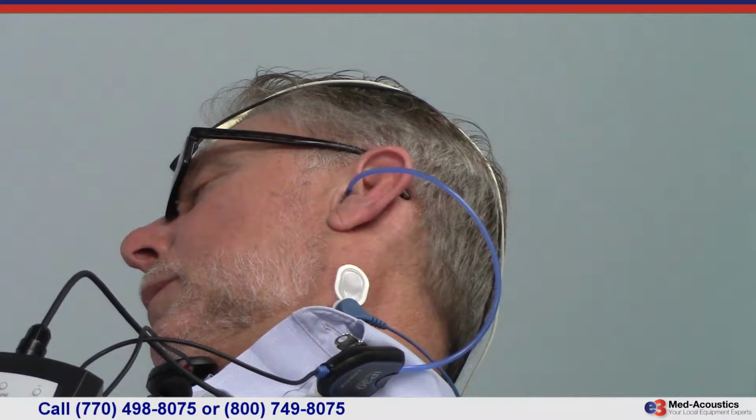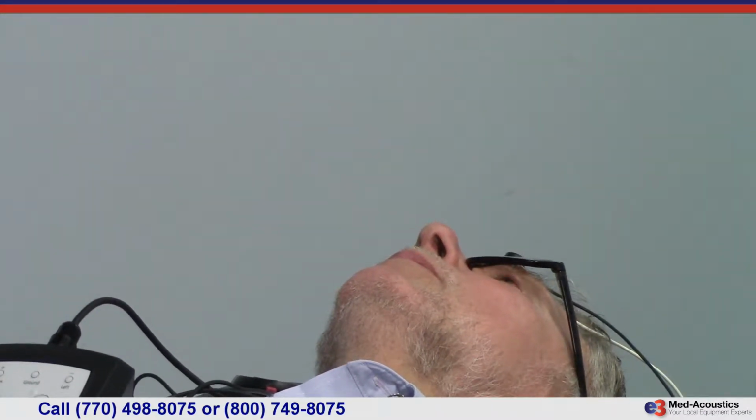And the position of the patient is important, as you'll see when we actually do the test, but we have them lying supine. And when we start the stimulus, we tell them to raise their head like this, 3-4 inches, so that they can see their feet from toe to heel, and then to turn away from the stimulus, all the way 90 degrees. I tell the patient to try to touch his chin to his shoulder. This gives you a maximal contraction of the sternocleidomastoid muscle and the best response.